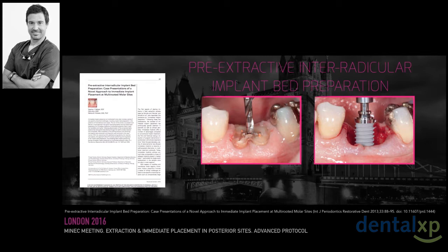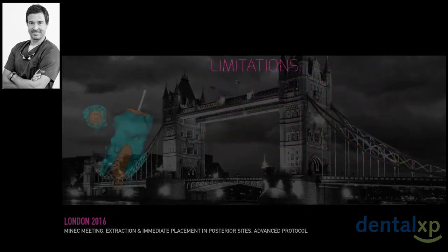But there are some limitations, of course. CBCT is mandatory in order to measure the remaining bone.